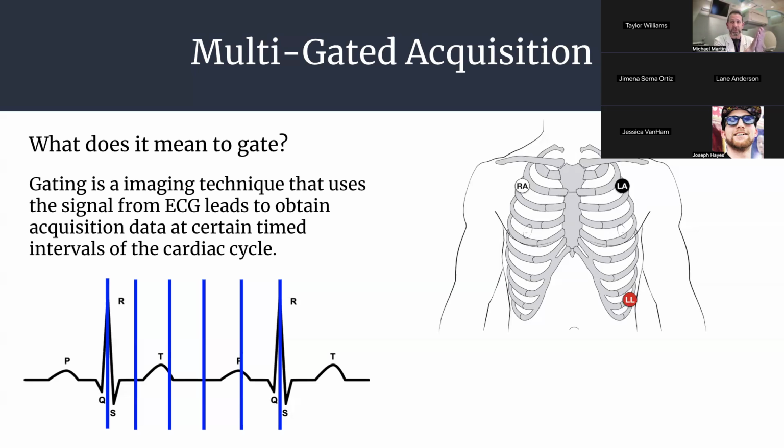Then what it allows you to do is go back and tell your computer, I want to grab the list that only represents atrial contraction, right? That represents the systolic contraction of the atrium. Or you can say, I want to grab the data that represents the relaxation of the ventricle, the diastolic. So we can take those and then put them into an image.